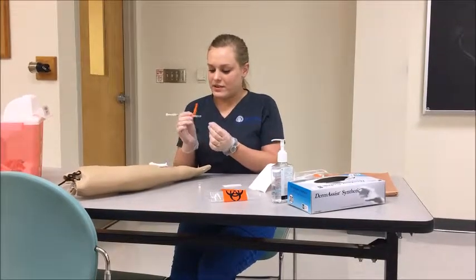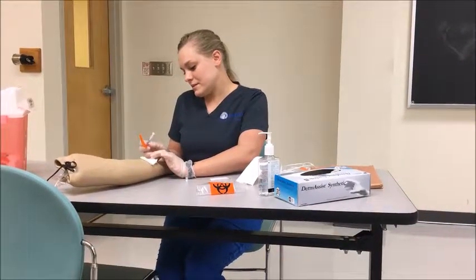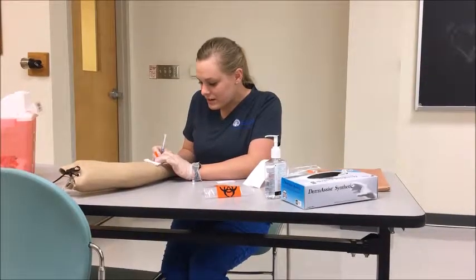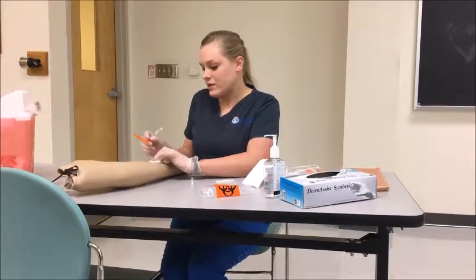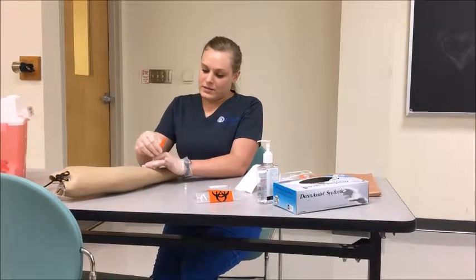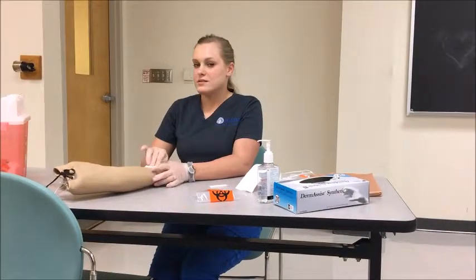Making sure my bevel is up. I position the patient so their arm is stabilized and I can get a good puncture site. I'm going to feel for the patient's pulse and then insert the needle at a 45-degree angle. Once I see that flash of blood, I fill up to the required sample size, then slowly pull out the needle and place it on the gauze. I cap the needle with my safety device, tap it a few times to remove excess oxygen bubbles, dispose of the needle in the sharps container, insert it into my stopper, let out the excess oxygen, and hold the gauze until the patient's bleeding stops.